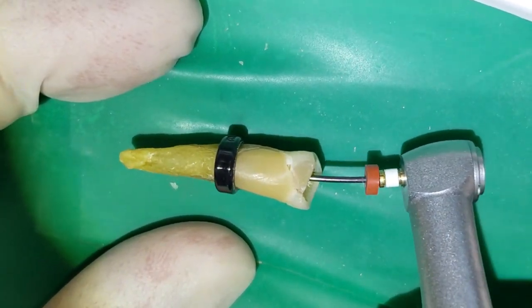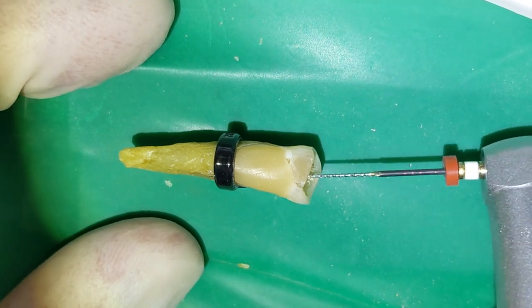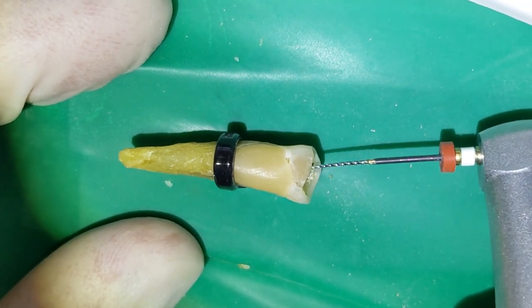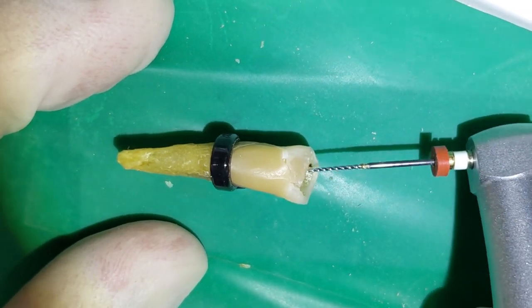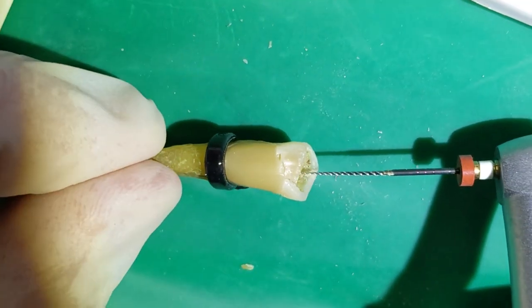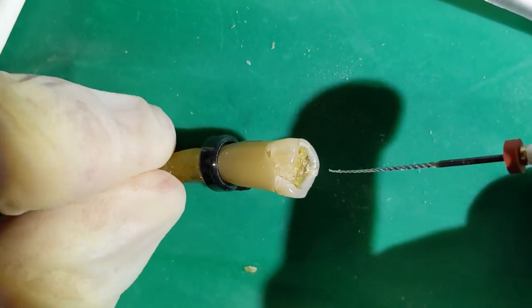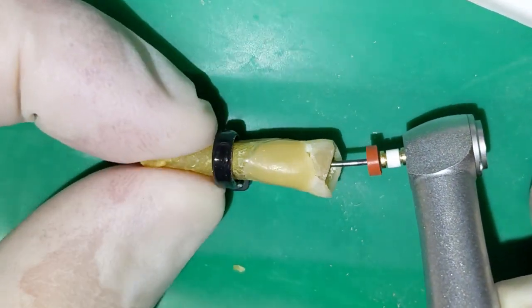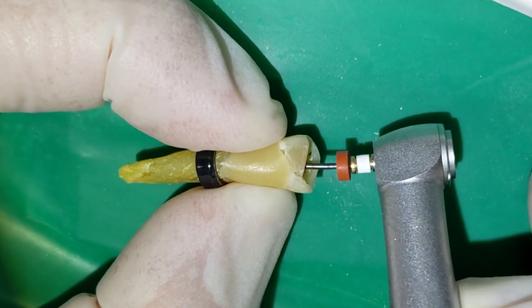brush it up and down against the side of the tooth, circumferentially all the way around. Clean from time to time. And basically what we're doing with this is we're going to work this file all the way down till the rubber stopper hits the tooth, and then I'll know that I cleaned it to the length I wanted it to be cleaned. Just work it in and out.